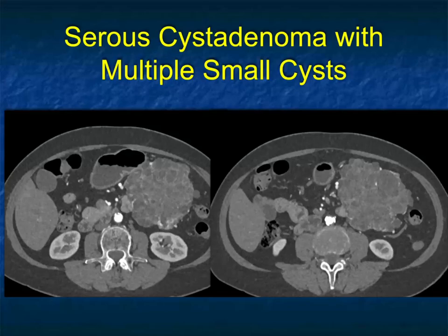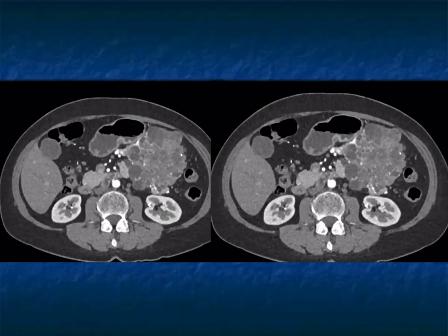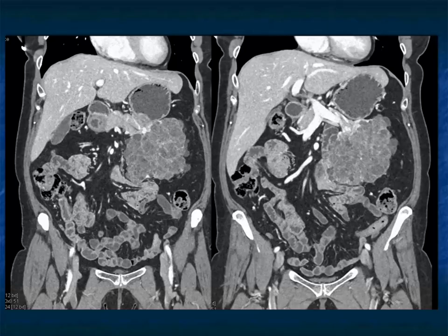Here's a complex cystic lesion in the body and tail of the pancreas with lots of septations, some faint calcifications, and small multiple cysts. There's nothing else in the differential - this is not the look of MCN, not a neuroendocrine tumor. This is the classic honeycomb appearance with a little bit of stretching of the vessels and faint calcifications - a really nice example of a serous cystadenoma. You can see why most cases are incidental findings, though others can cause mass effect when large enough.